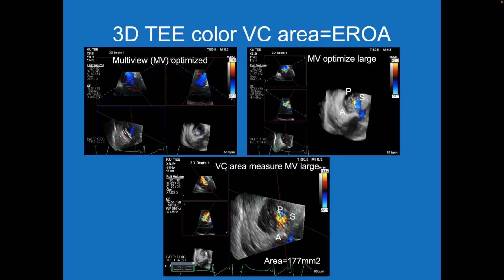So it's very important for the sonographers to help their physicians, but also because I think this is going to be coming into the transthoracic realm, to be able to learn how to use the software, and the physicians have to understand it so they can make the best measurements. But it's very useful having these live multiplanar reconstruction views on these wonderful new machines that the vendors continue to improve.